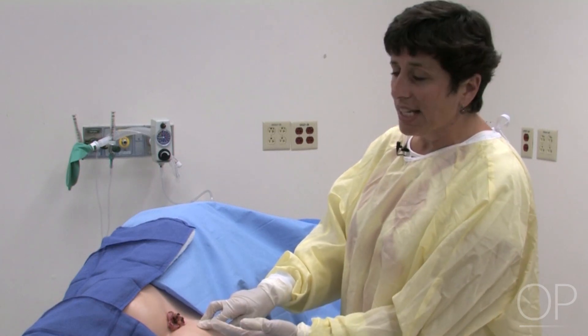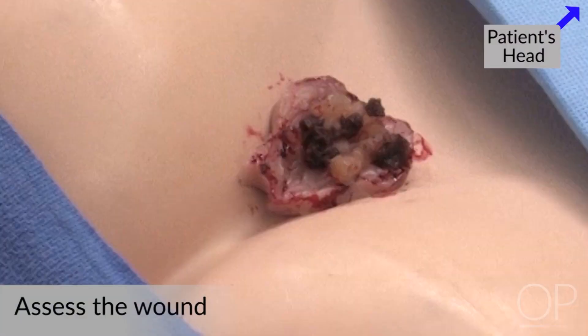The first thing you want to do is get an overall assessment of what the wound looks like and the surrounding tissue around it. At first glance, this is a rather large wound and it has a mixed wound bed. There's some black eschar as well as some yellow slough in the wound, and some granulation around the edges of the wound and some bleeding, which would be a sign of some healthy tissue.